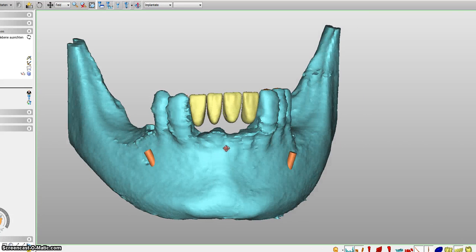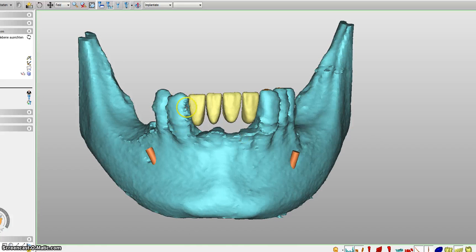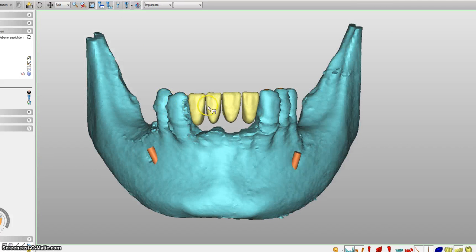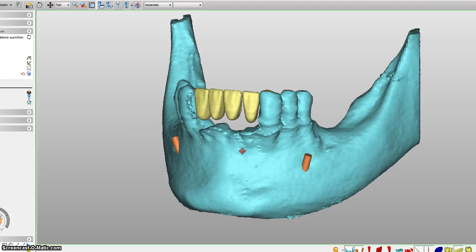Just to simulate it, these teeth, which will be replacing the teeth which we have pulled out, will be held by the teeth before and after the gap, so to the right and the left side. Okay, this will be all in one piece, so you can chew again, and aesthetically it's a very, very convenient solution. Now let's talk about the back.